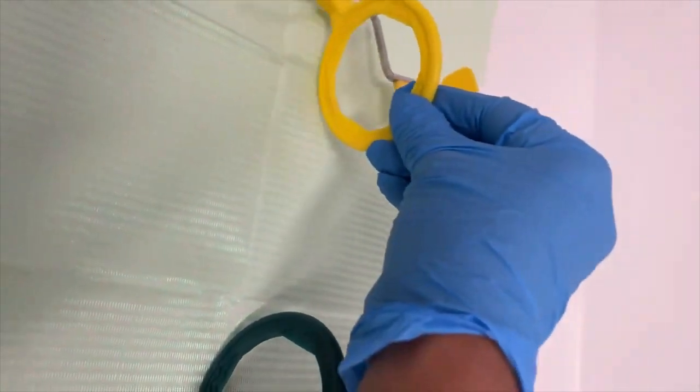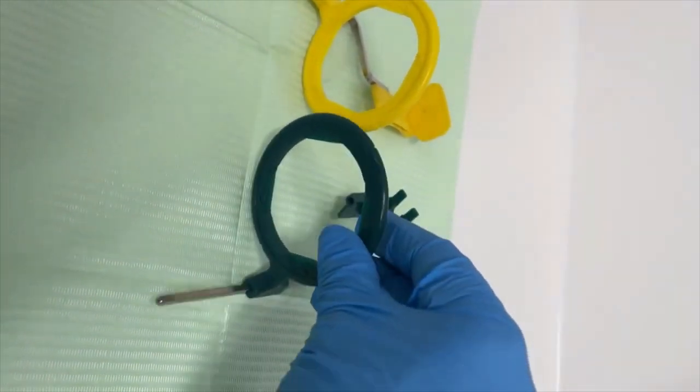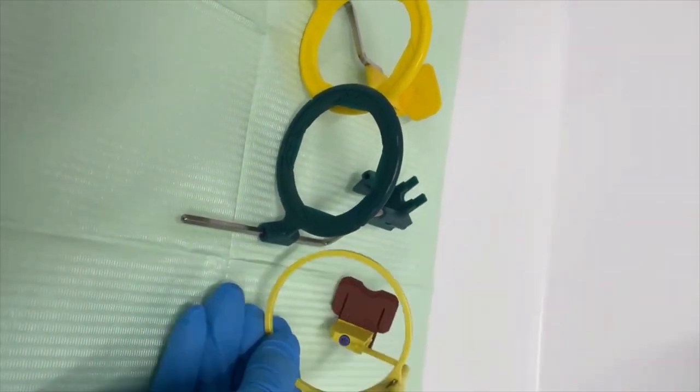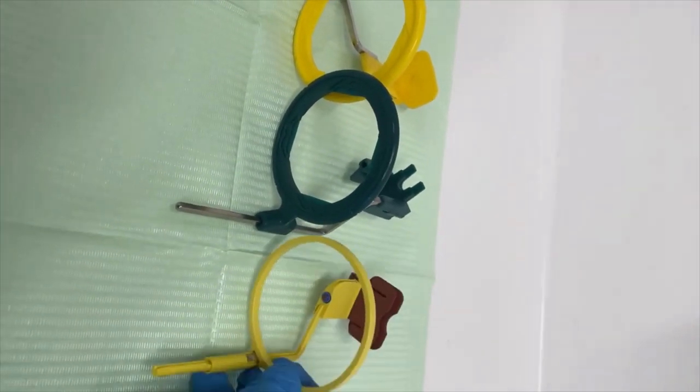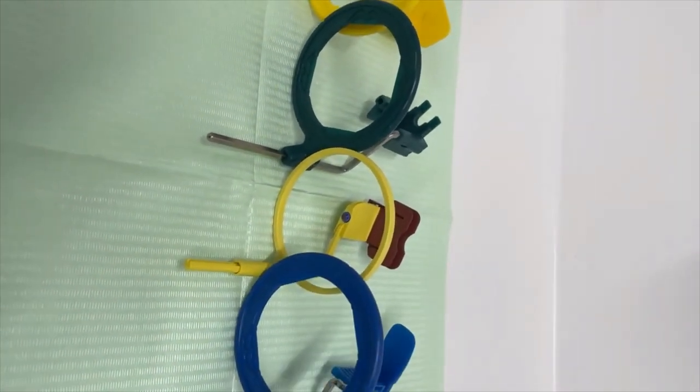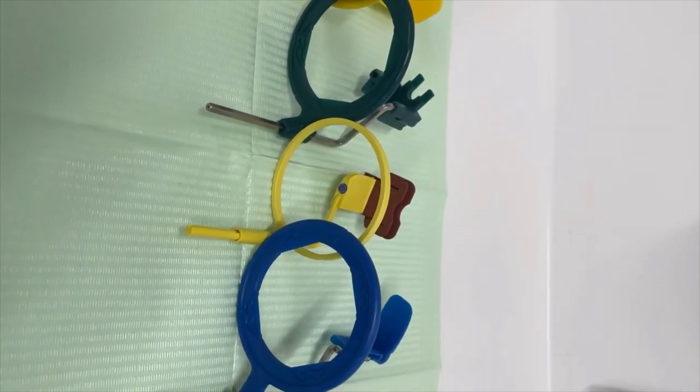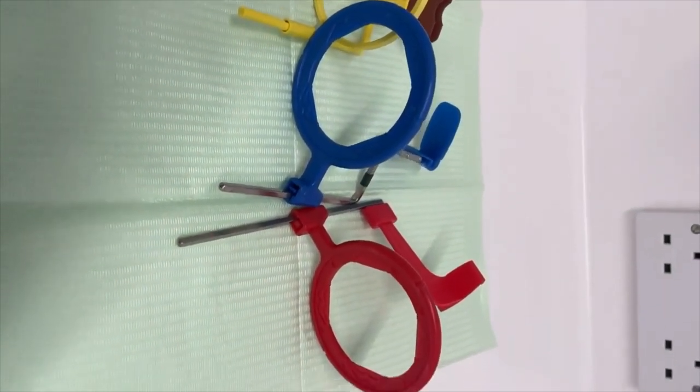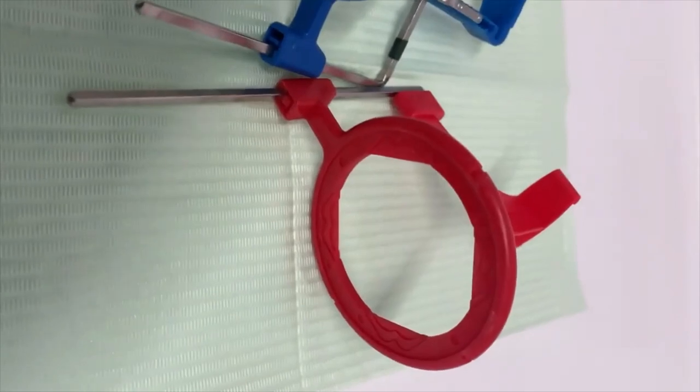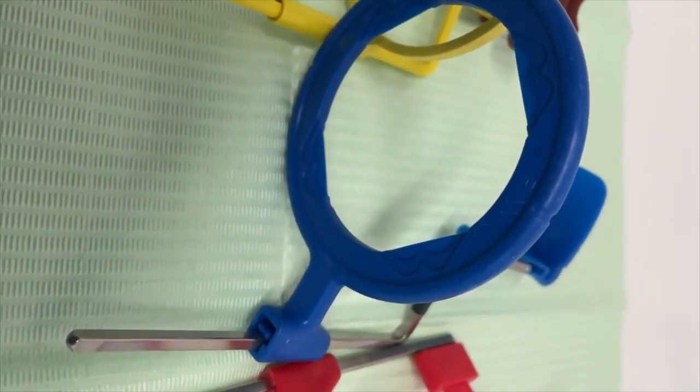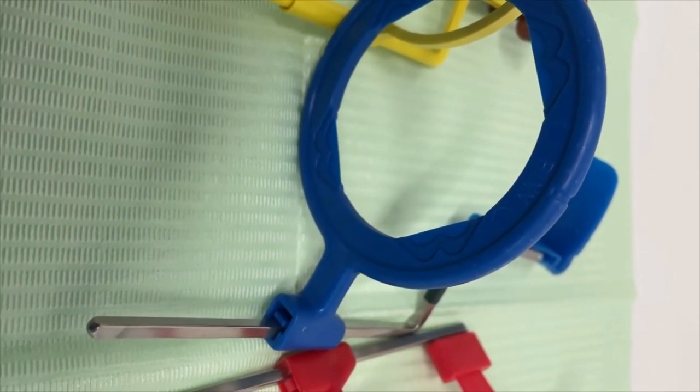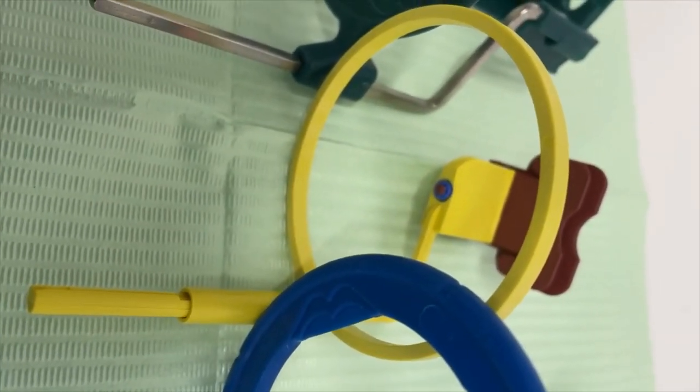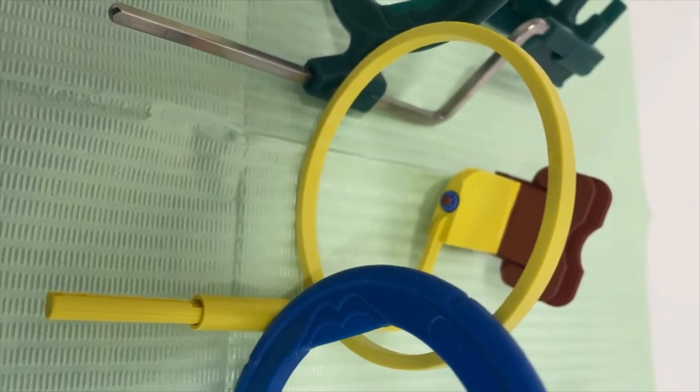So there are different kinds or different styles of x-ray holders, but I'm just giving you an idea of how an x-ray holder looks like. So there you go, that is the bitwing holder. This blue is the anterior periapical holder, and this yellow one is for posterior periapical holder.